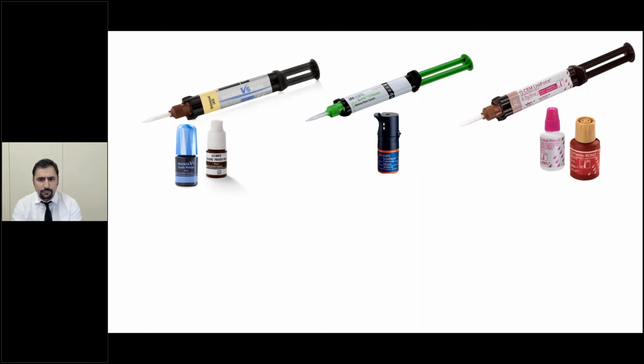Now, again, these can be used in two modes, total etch and self-etch. Total etch means that I'm going to etch my tooth with phosphoric acid, sorry, for 20 seconds, then I'm going to use these products. Or I simply don't etch my tooth structure and I just use these products. But we have another generation of cements that are self-adhesive.